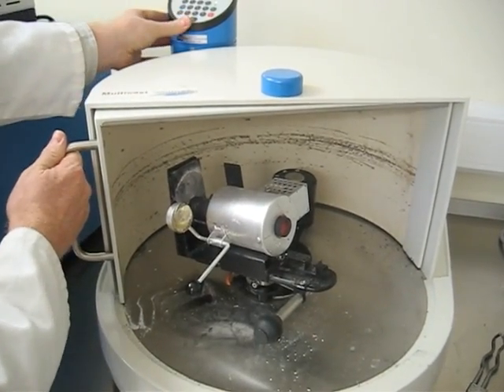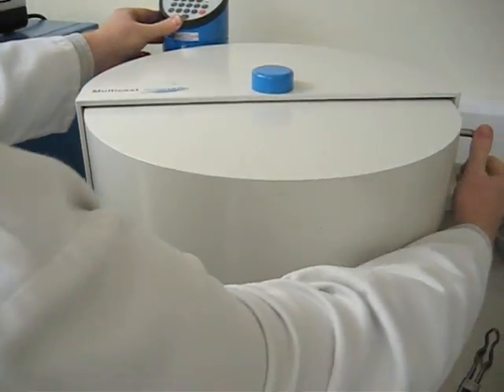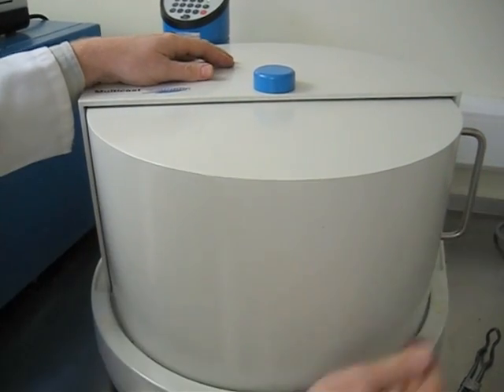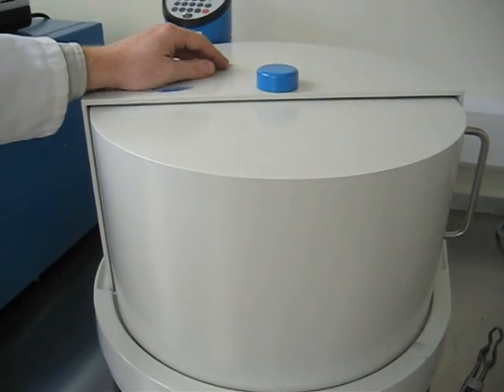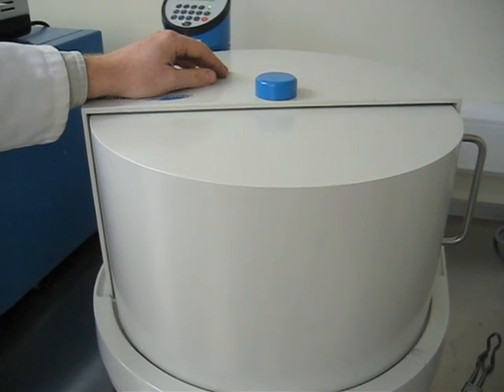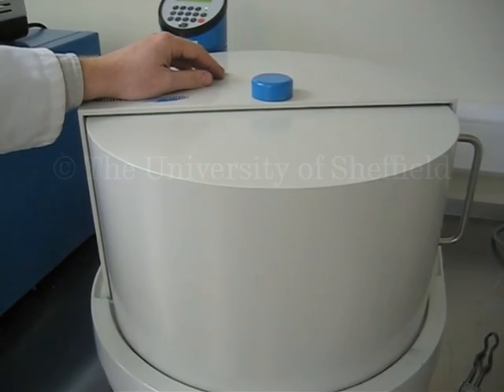And then you shut the door. There's a micro switch on the door and you can see the machine virtually leaps off the desk. Off it goes. Spins around. Centrifugal force pushes the metal into the mould. For a number of minutes. About three minutes. Job done. Excellent.